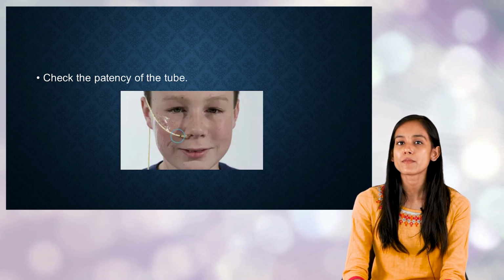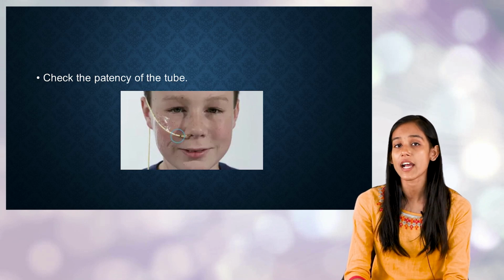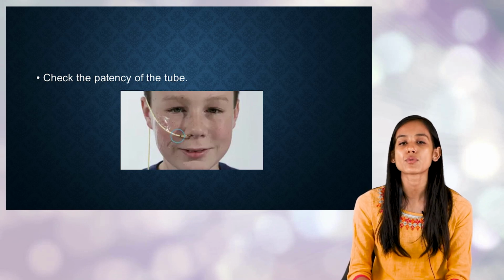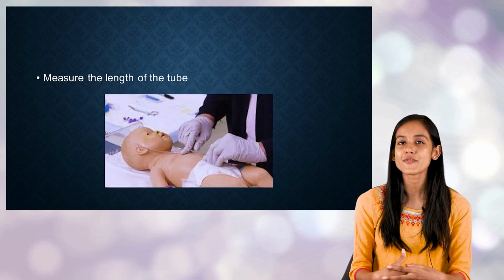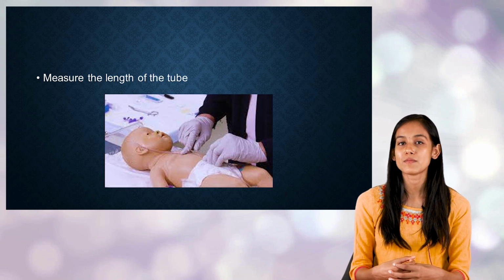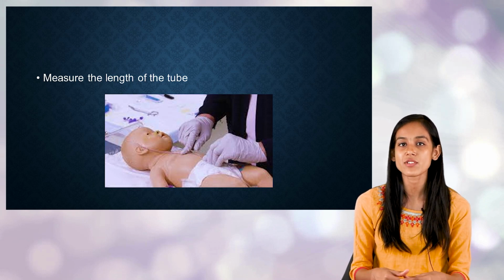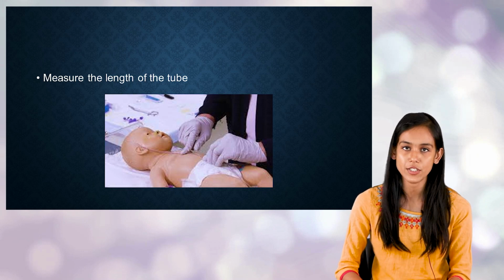So this can bring a very major complication, and to avoid that, it is always advised that before feeding the child, you should always check for the patency of the tube. So here the first question is how to know how much tube is to be inserted, right? First, we have to measure the tube. So we are going to see how to measure the tube.